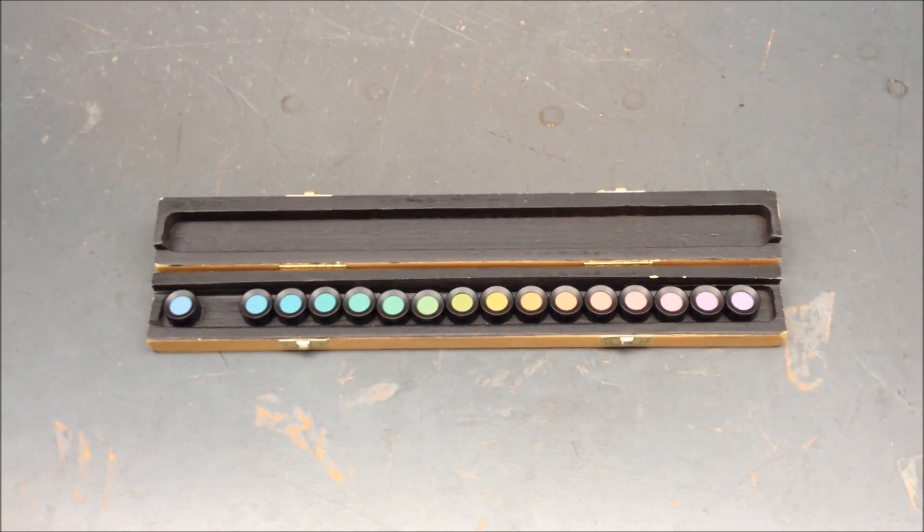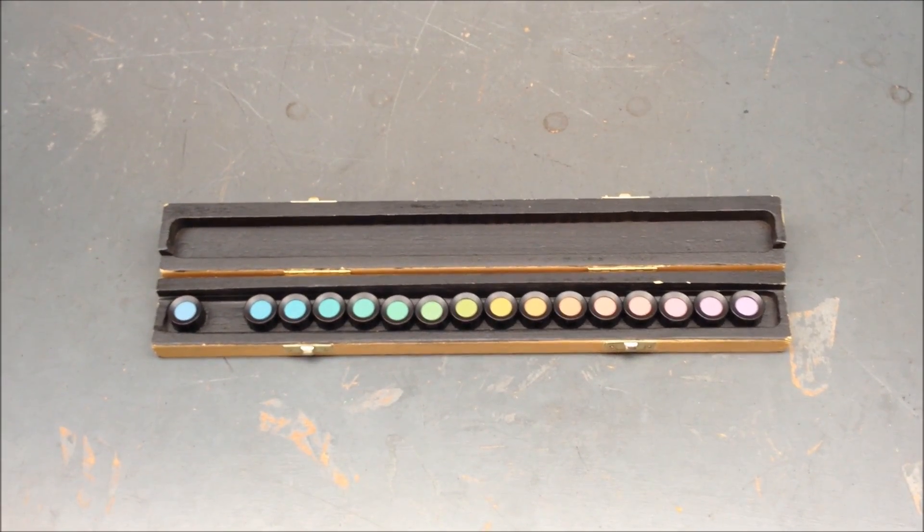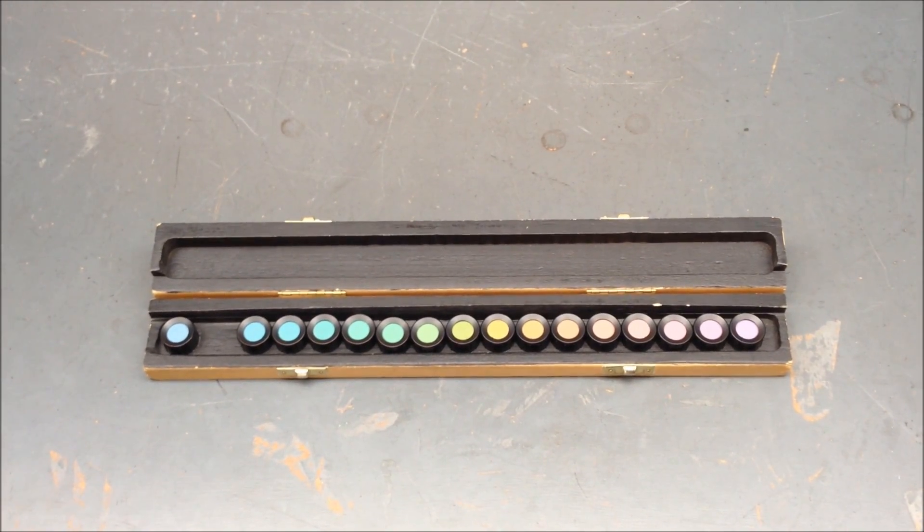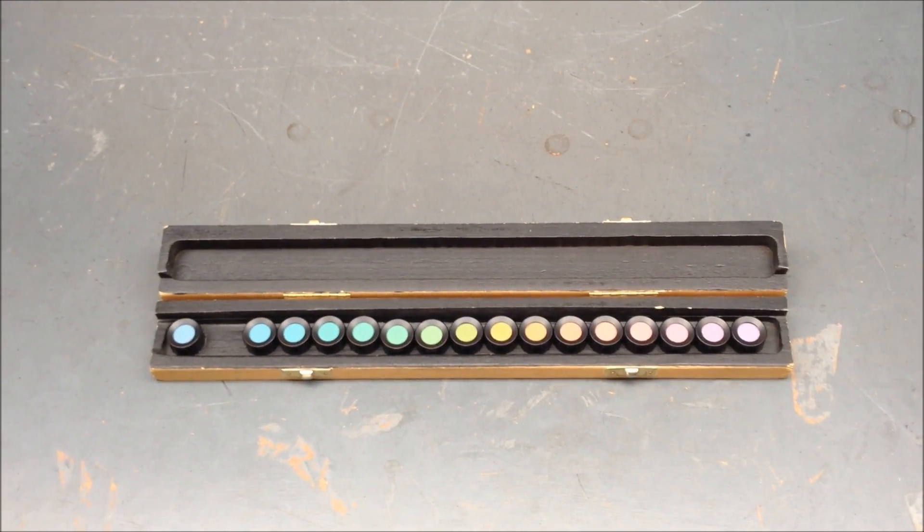This is the Farnsworth D15 test. This test is used throughout the world as a grading test for occupation selection. The patient has to arrange 15 moveable hue samples into a natural color sequence which you see here.